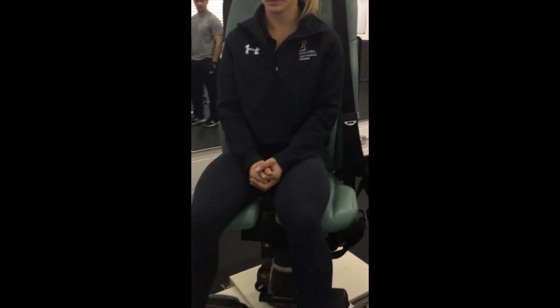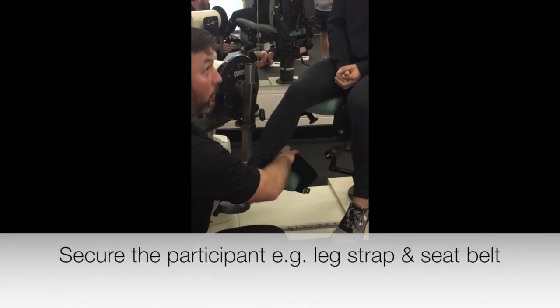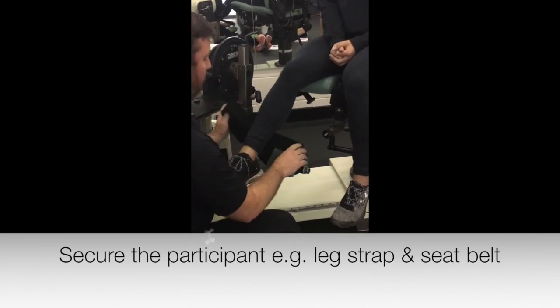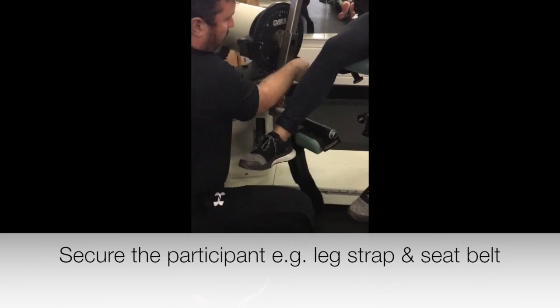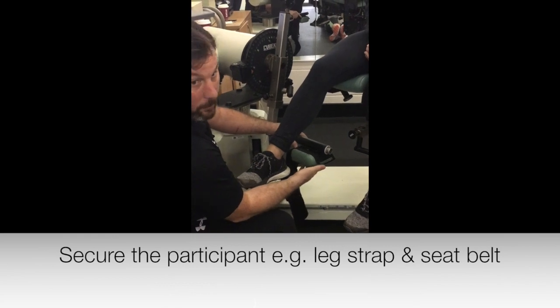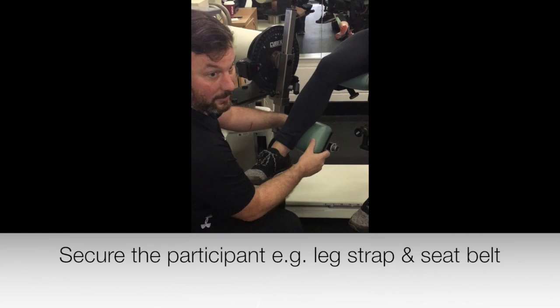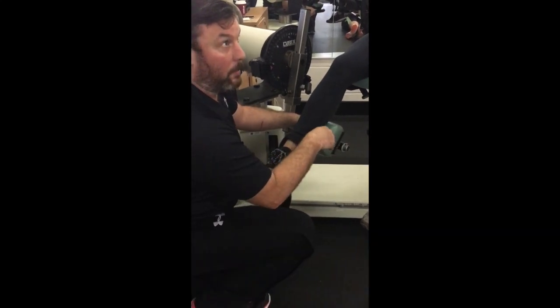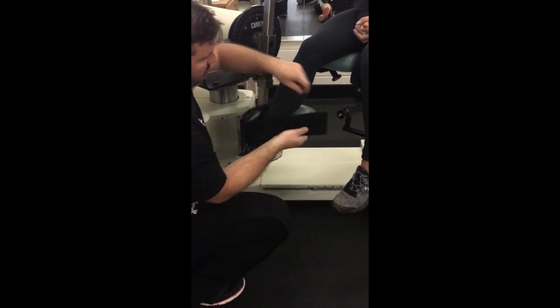But what we will do now then, depending on what you're testing, depends on where you want your pad. You're going to have to experiment a little bit. So if you're doing quads, I would put this green bit in front of the shin. If you're doing hamstrings, I would put it behind, because that's the muscle you want to measure. That's the one that's going to be able to be pushed against the most. So I'll just do it like this for today, because you'll be able to see.